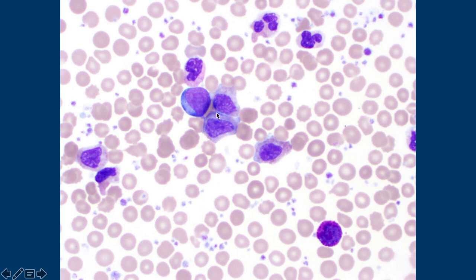They're young myelocytes because they have a little bit of that blue tinge — they're getting their secondary granules. They've transitioned from the promyelocyte stage where they only had primary granules, and now they're getting their secondary granules. This is a slightly older myelocyte and you can see it's more pink, looks more like a neutrophil — but they're still myelocytes.